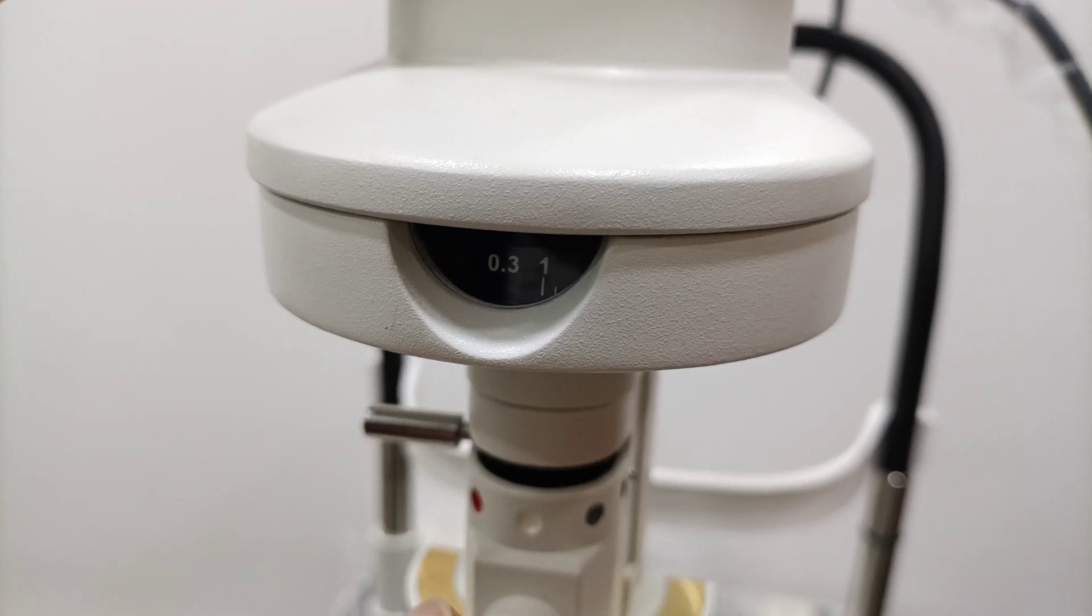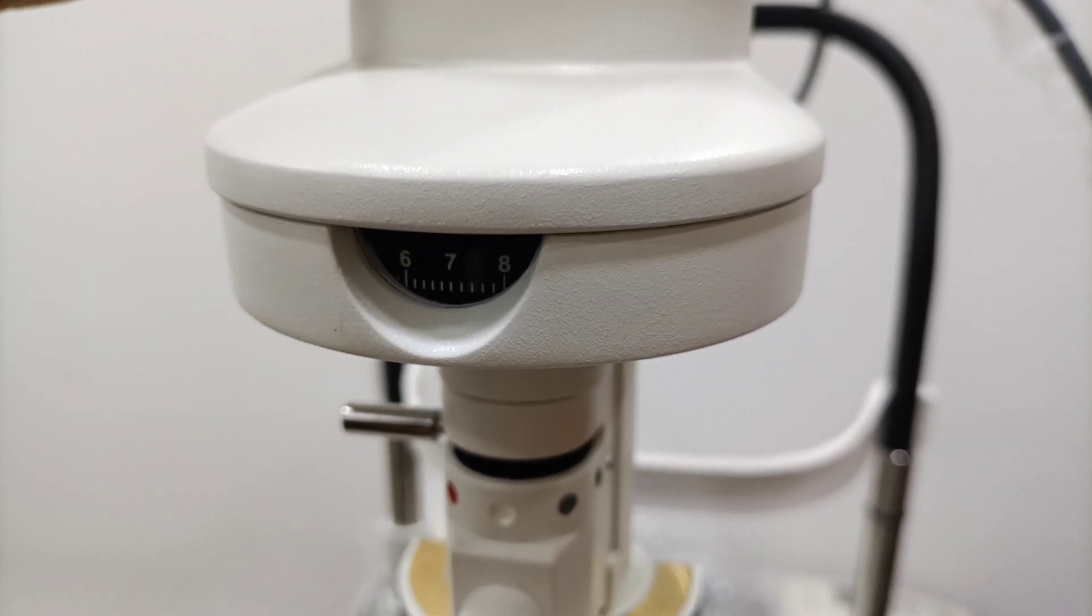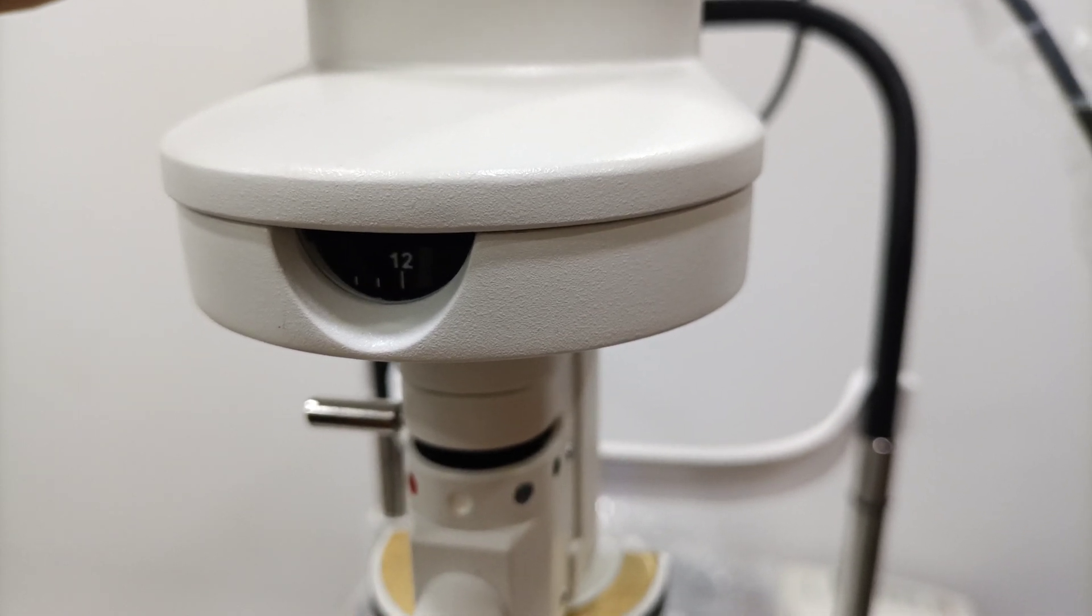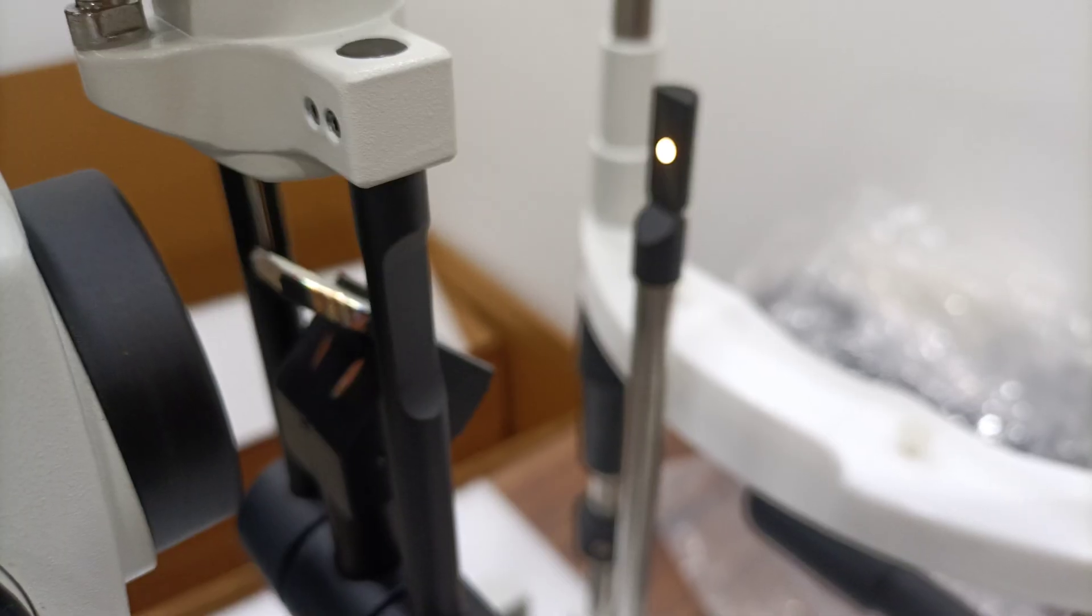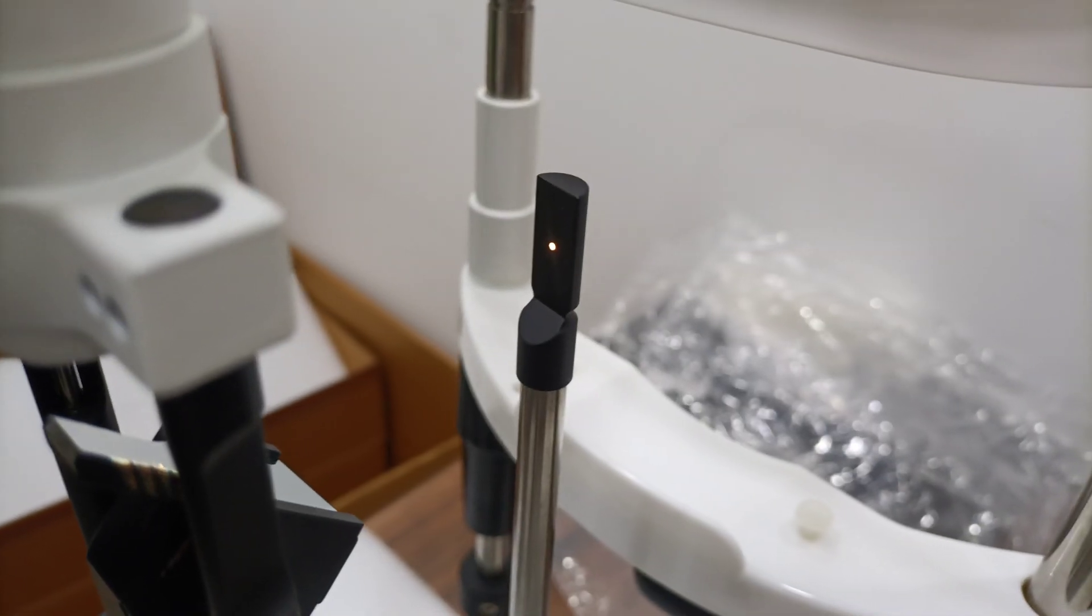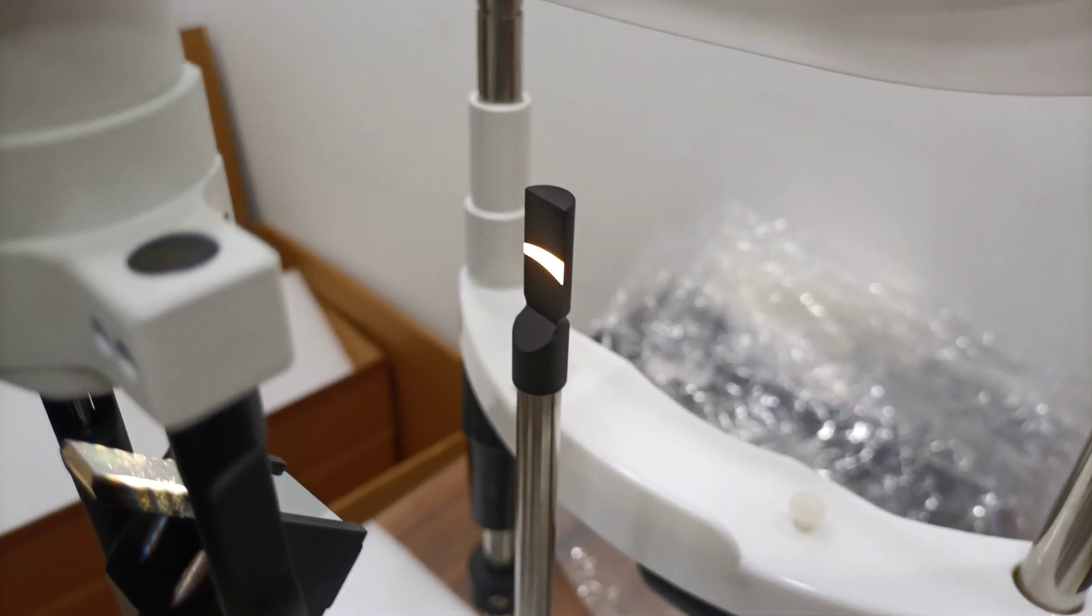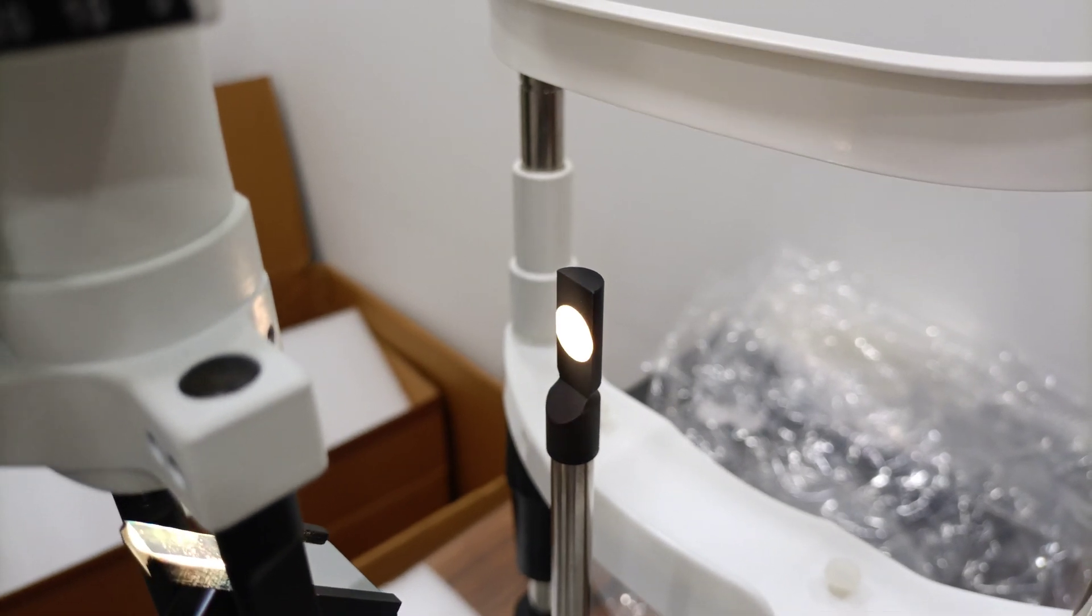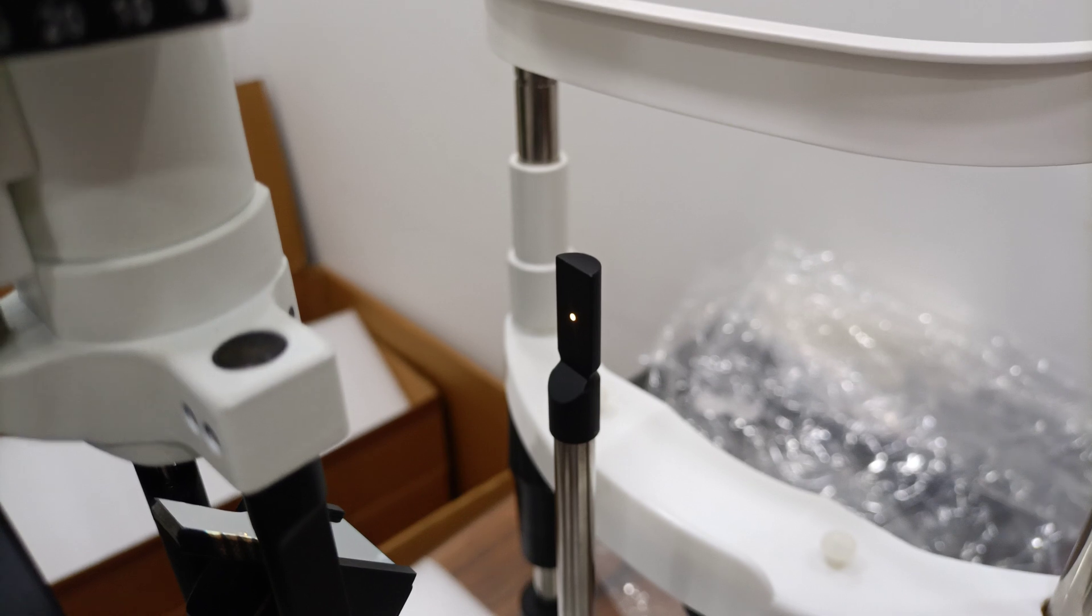Aperture available. 0.3, 1, 2, 3, 4, 5, 6, 7, 8, 9, 10, 11, 12, and other aperture sizes available.